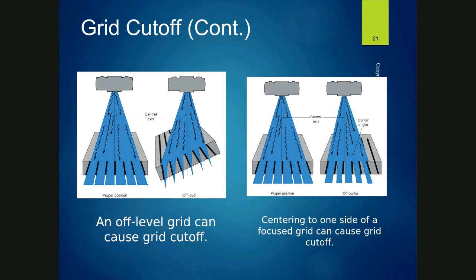Not just because it's the most common kind, but when you think about what's happening, if you're going to do a portable abdomen and the patient is a very large patient, for one, you can't see exactly where the grid is up underneath your patient. Sometimes you can't feel up underneath the patient. And then, of course, with our hypersthenic patients, sometimes they look straight when you go to x-ray them, but the inside of their bodies is not straight.